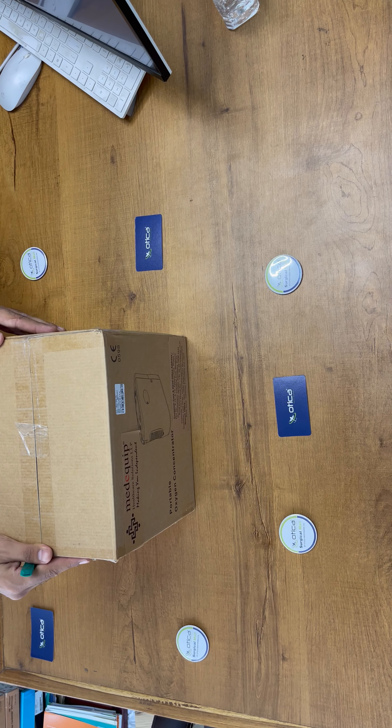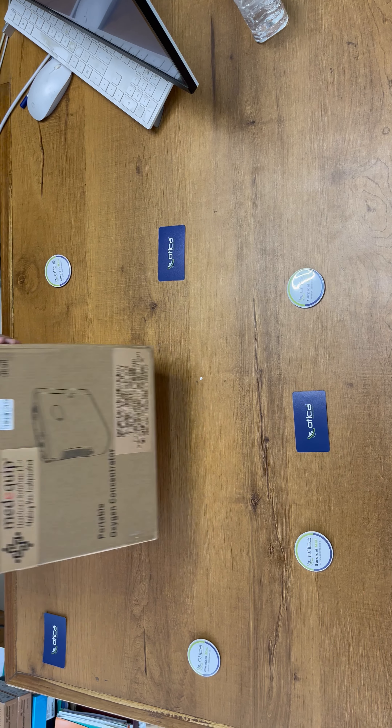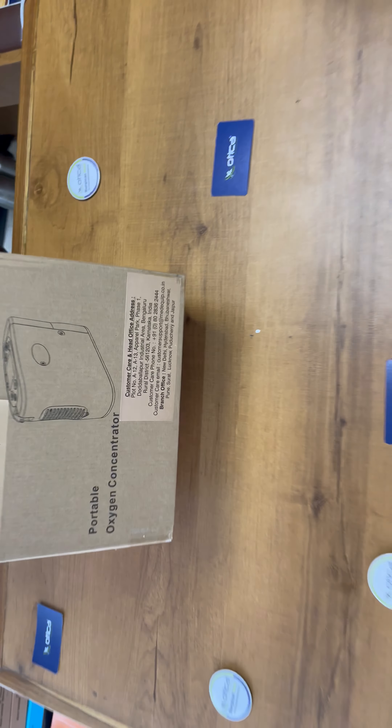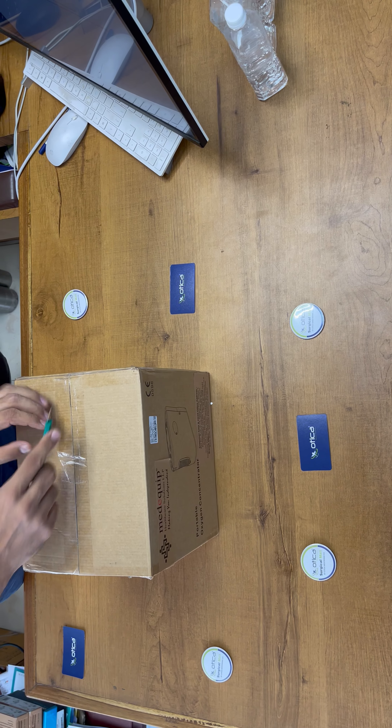Hello friends, welcome to Otika Meditronics Company. Today we are going to demonstrate and unbox the Mediquip OxyMed oxygen concentrator. This is the portable oxygen concentrator which has a weight of just 2 kg. We are going to unbox it.